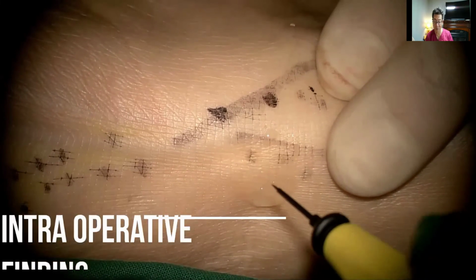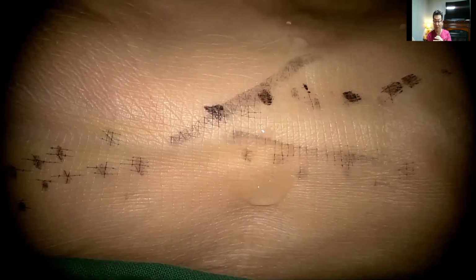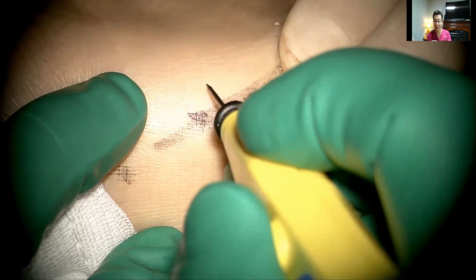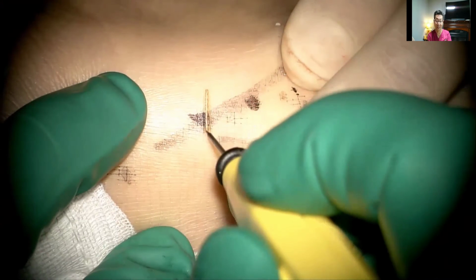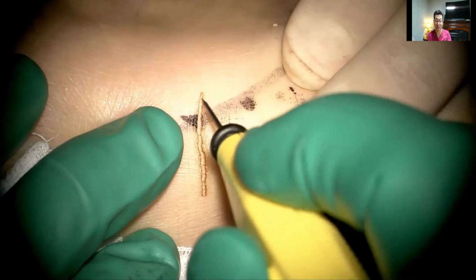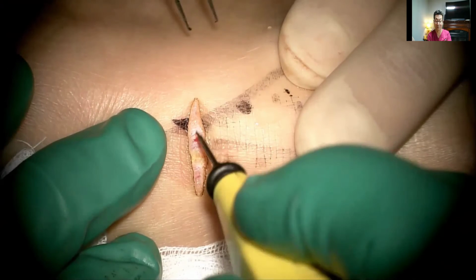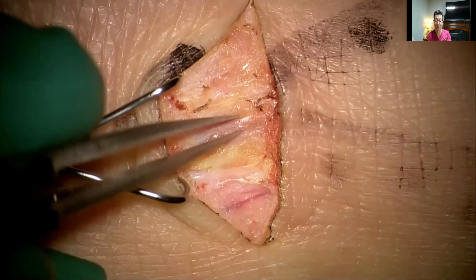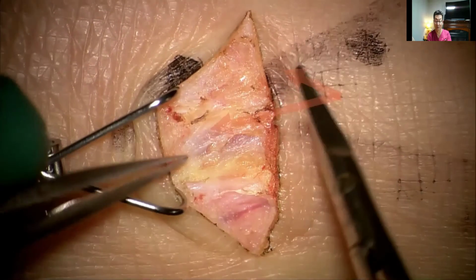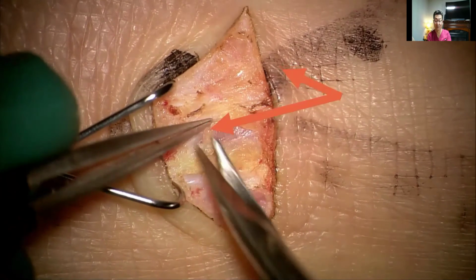So in this patient here, which is around an early stage 2 patient, in regards to the mapping, what we want to do is approach the region where it's the closest to the vein and the lymphatics, and we go through, and then we make the incision, trying to identify and see if it correlates to the findings that we saw under the ultrasound. So here you can see that the vein is being correlated.